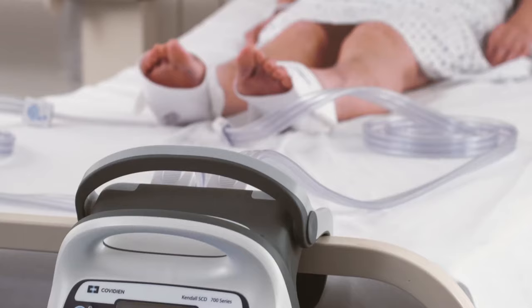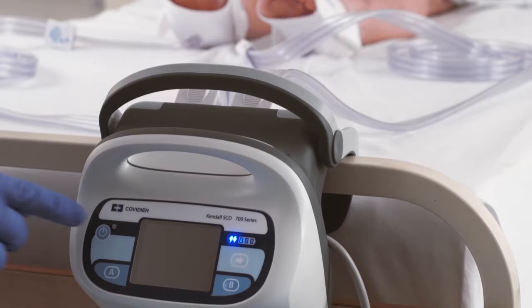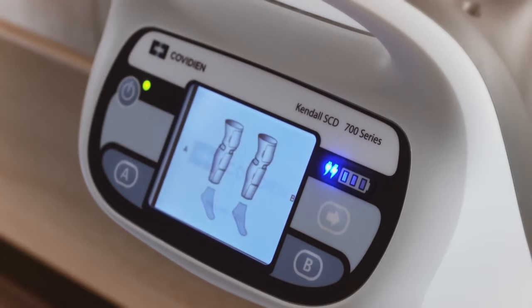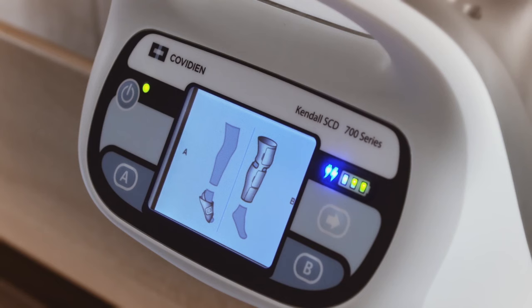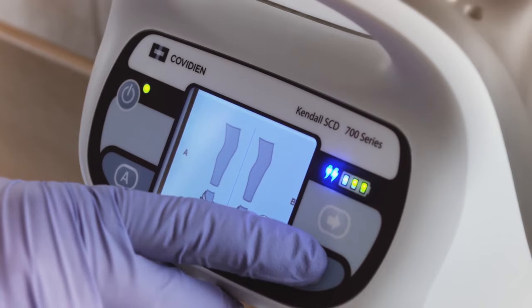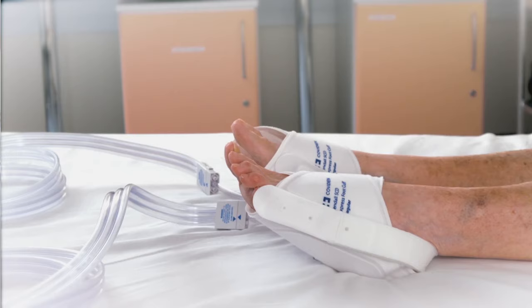If a Kendall SCD Express foot cuff is being used, the user must indicate this during the garment verification procedure at the start of therapy. During the startup process, the port A and port B leg images will blink to indicate the default garment configuration, which is leg compression. Pressing the A and/or B buttons will cause the corresponding port's leg image to shift to a foot image, indicating that foot compression is desired.